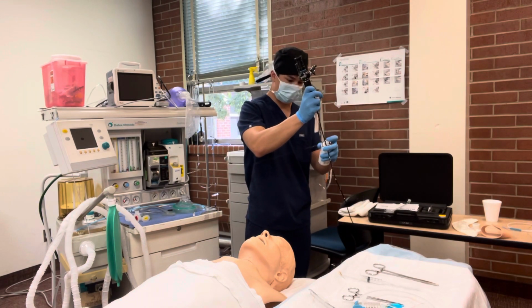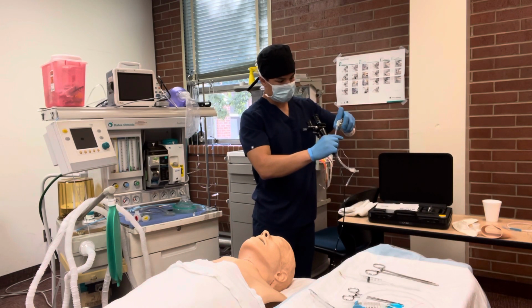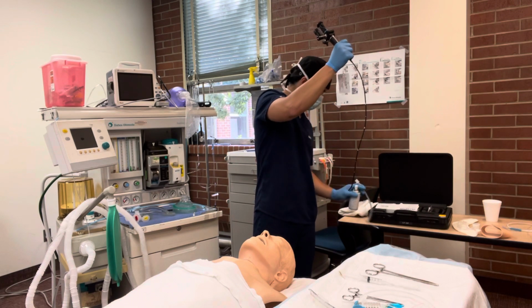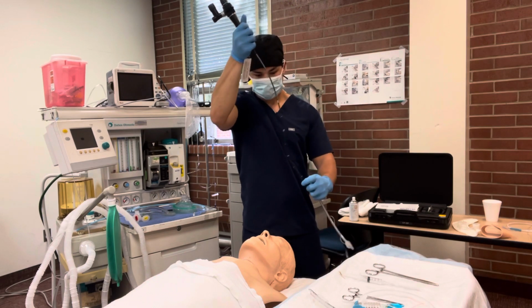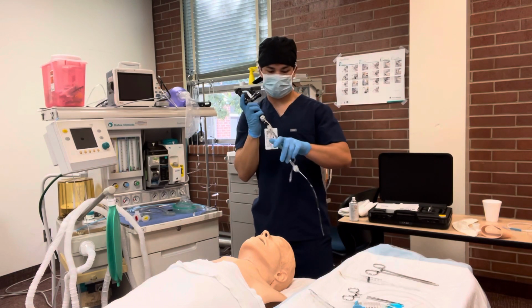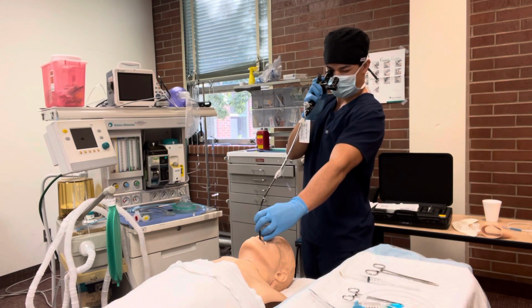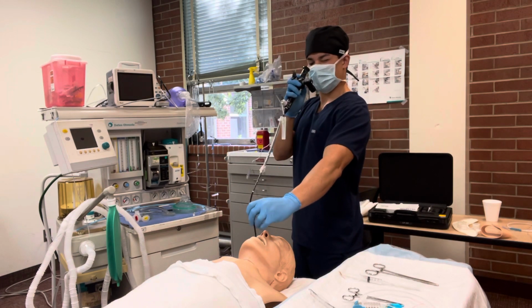So here's my scope. I'm going to lube this up. I'm going to extend the bronchoscope, insert into the airway. Turn on my light first.